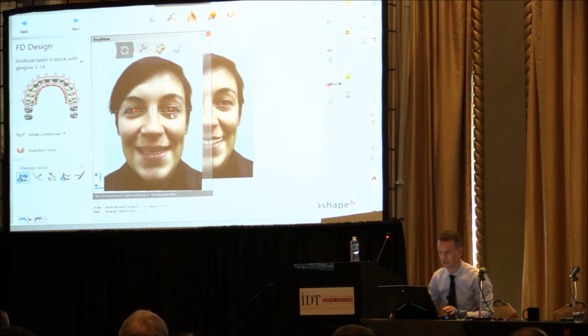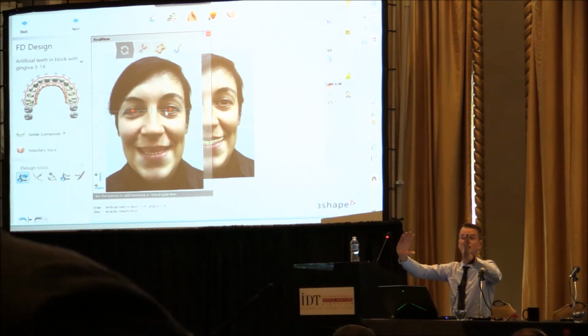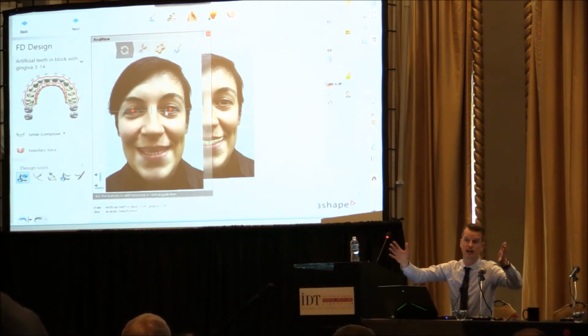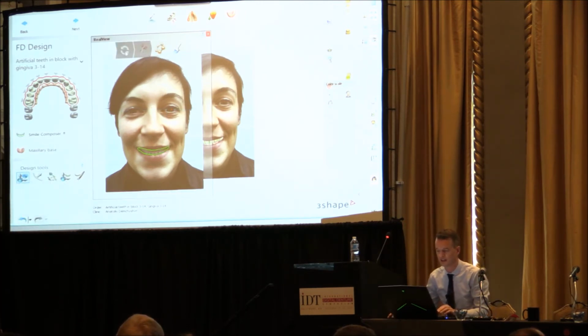So here you can see, at first I put some points here. Let me delete the lines. I can click the pupil points, and that is going to adjust my image. This image could be taken with an iPhone, with a proper high quality camera, or with whatever you want. I can then click next here. Oh, sorry. I can add vertical lines here if I want. I need to adjust this a little bit. I can add one more out here on the nose.